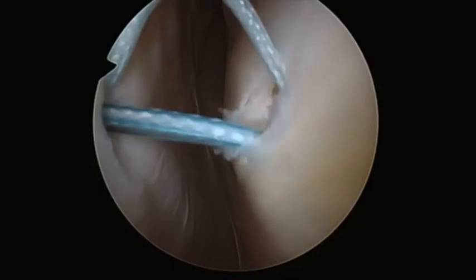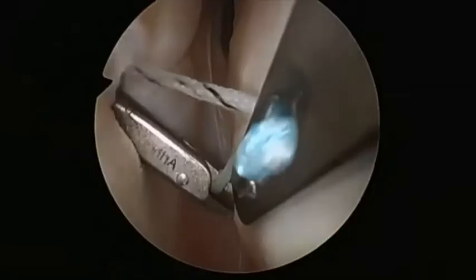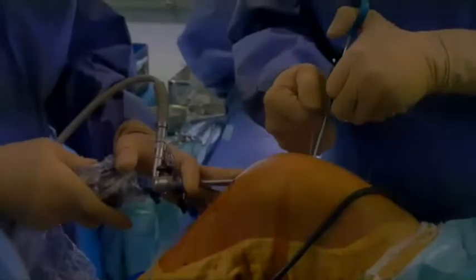After the button is flipped, the second fiber wire from the femoral tunnel is used to shuttle the two luggage tag sutures that are in the ACL remnant. They are shuttled through the femoral tunnel, which can again be directly visualized with the arthroscope. The sutures are then tied over the button using a knot pusher with the knee at 90 degrees of flexion.